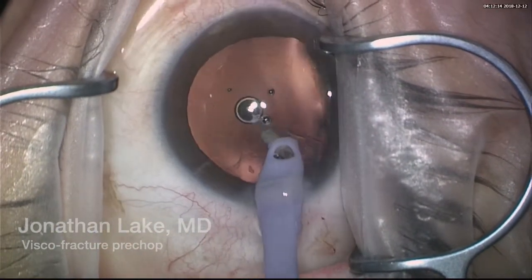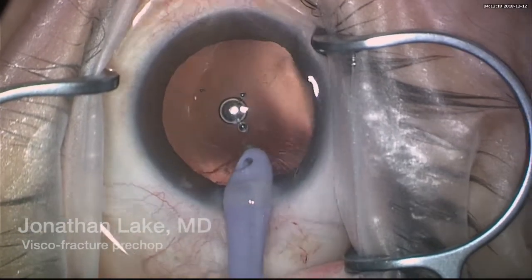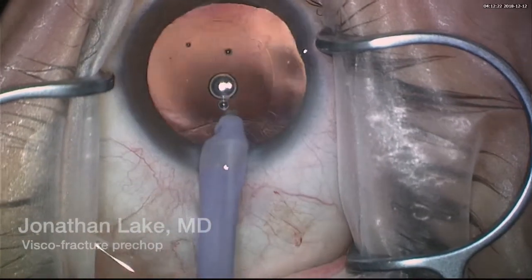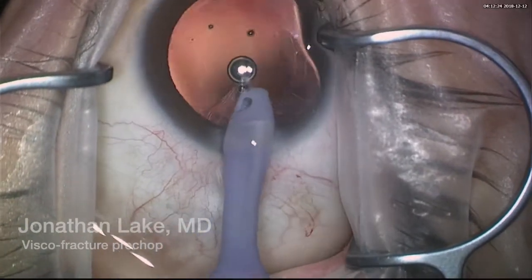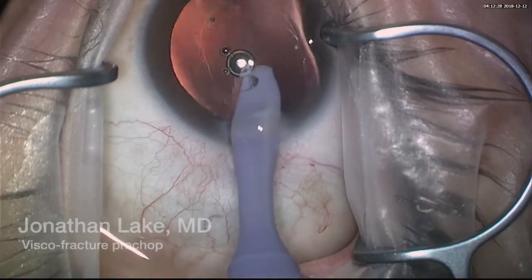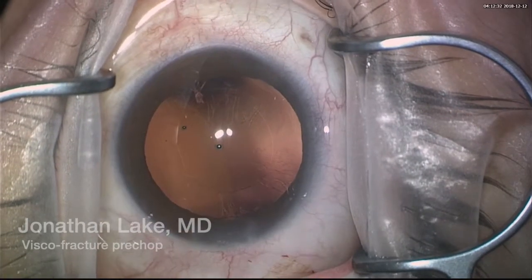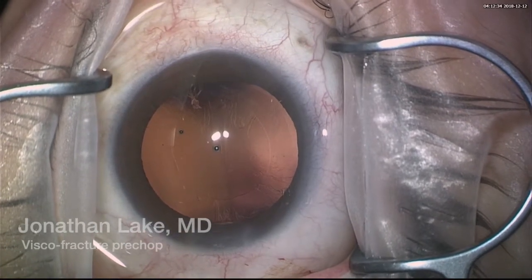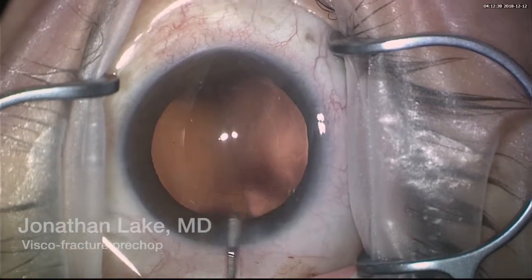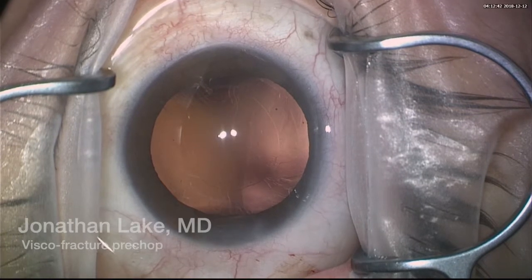Here we'll aspirate some of the cortex that was adhered — it wasn't released with the hydrodissection — so we carefully aspirate this. We can see that the chamber is pretty stable throughout the whole surgery, and here it's ready for insertion of the ophthalmic viscoelastic device.